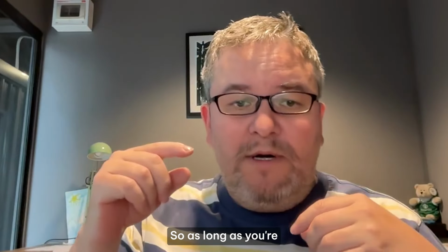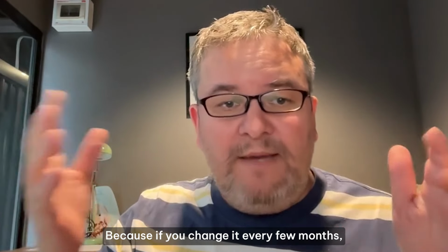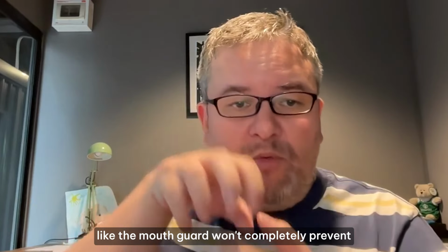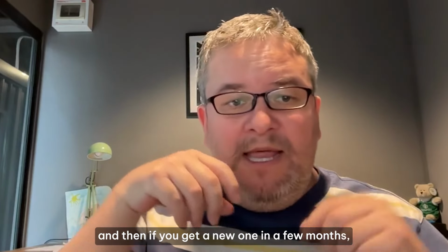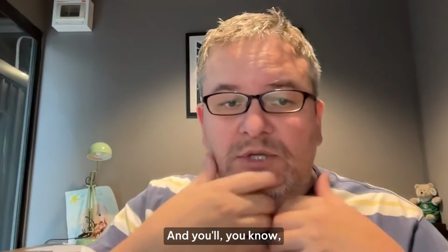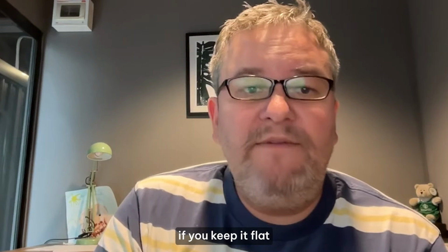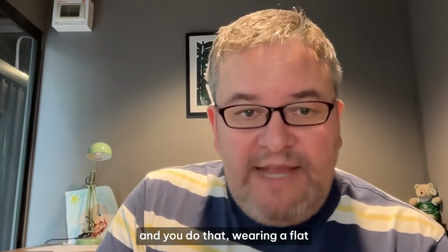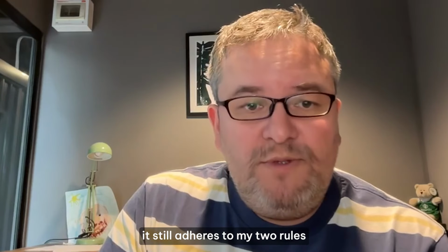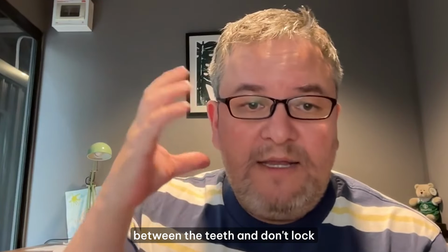As long as you're keeping it flat and changing the custom mouth guard every few months, it's okay, because if you change it every few months, the lower teeth that it's sitting on will still be able to move. The mouth guard won't completely prevent the lower teeth from moving. And then if you get a new one in a few months, that'll capture the new position of the teeth, and even the lower arch will be able to continue to evolve, which is important. If you keep it flat and you do that, wearing a flat custom mouthguard, you will actually improve. It still adheres to my 2 rules of these biomechanics, which is, put height between the teeth and don't lock the upper and lower teeth.